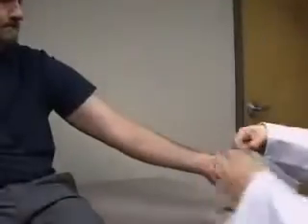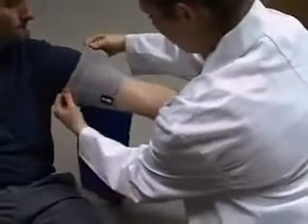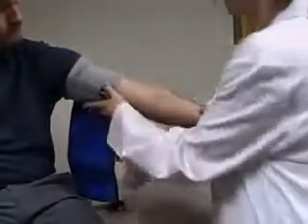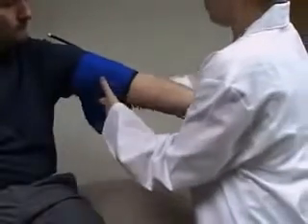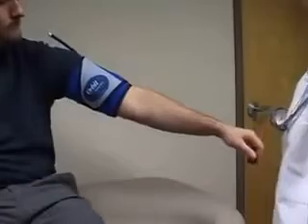Once the appropriate size cuff is selected, slide the patient's arm through the stretch sleeve. This patented feature is designed to keep the cuff properly placed over the brachial artery through the duration of the study. Place the artery marker or arrow directly over the brachial artery and wrap the cuff snugly around the arm.